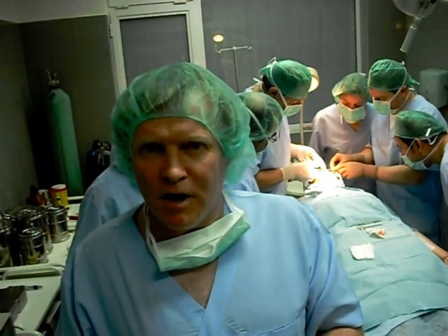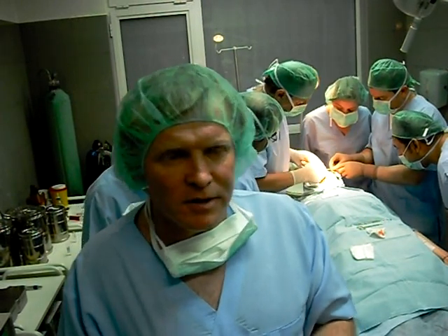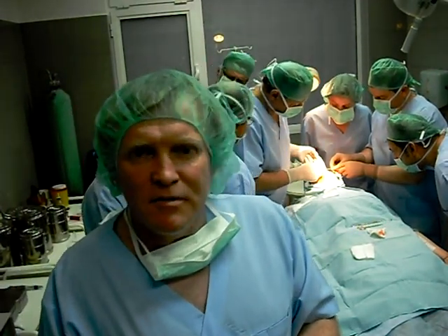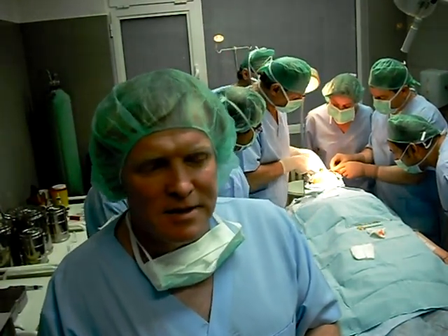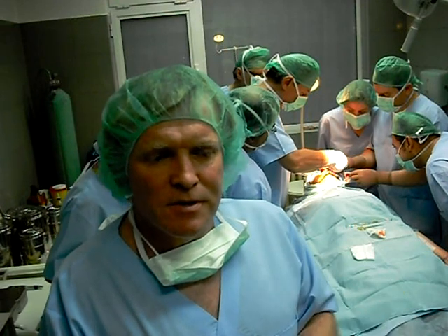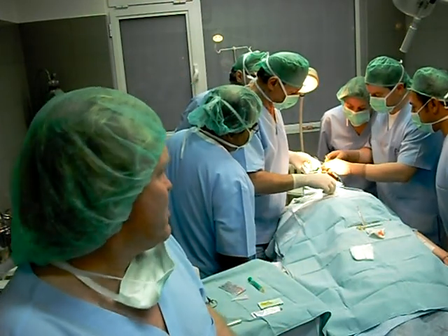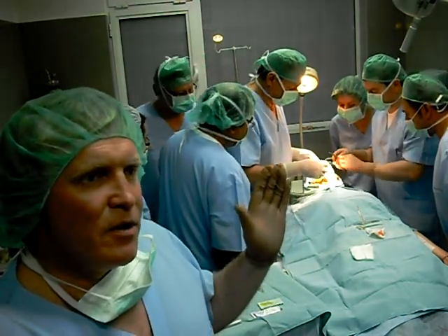Here we are in Dr. Sherdev's operating theatre in Sofia, Bulgaria. What we're looking at today is a practically atraumatic, bloodless method of doing a rhinoplasty, particularly for people who have humps in their noses, where we can do a three to four stage procedure.